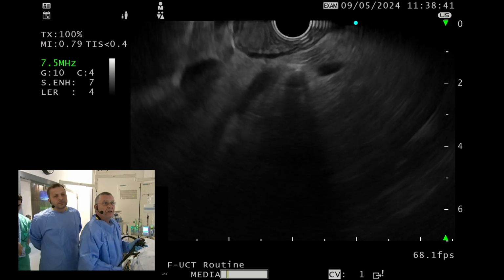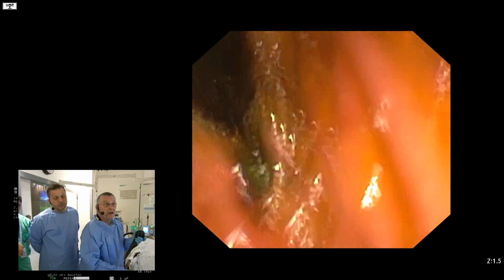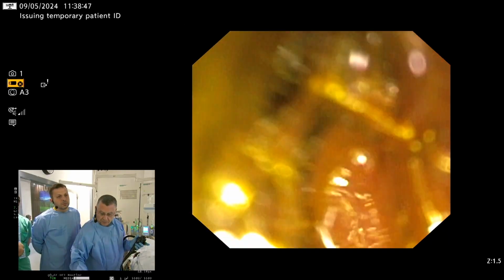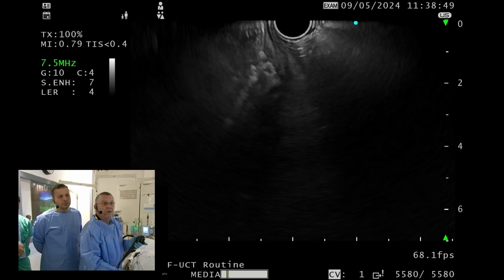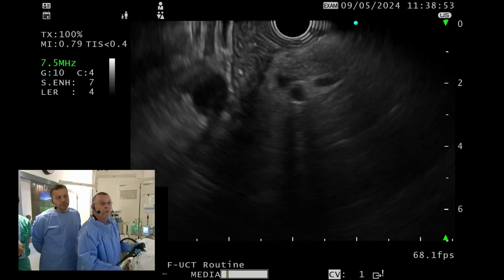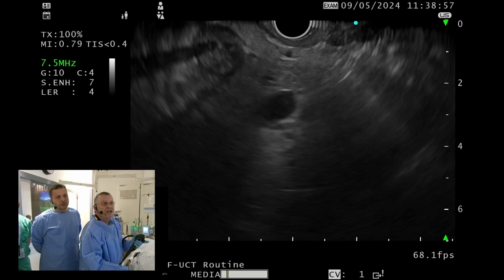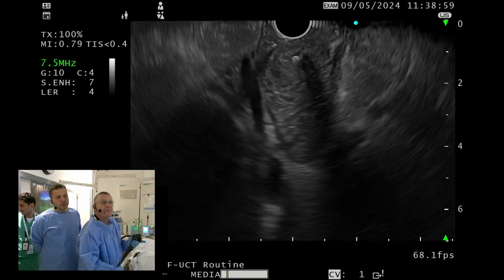Okay. So Dr. Palazzo, now I was thinking about the size. The size is very scary here. And it looks now to me more than 3 centimeters. I will work, if you want, to show you the key of the exam, which is the staging.